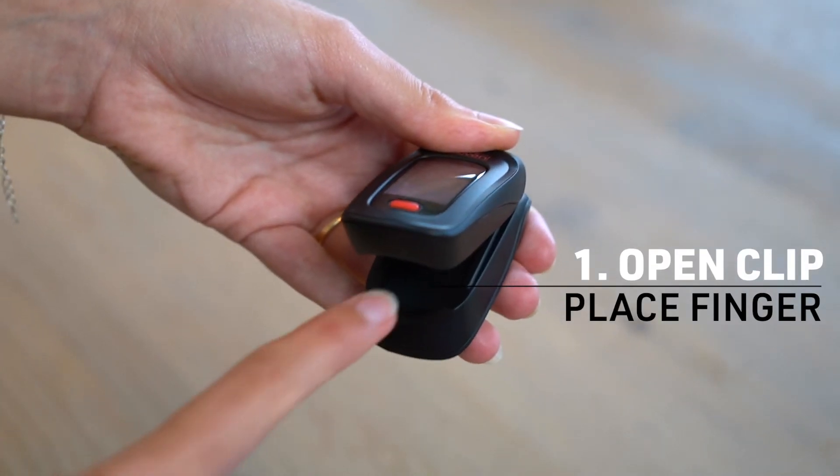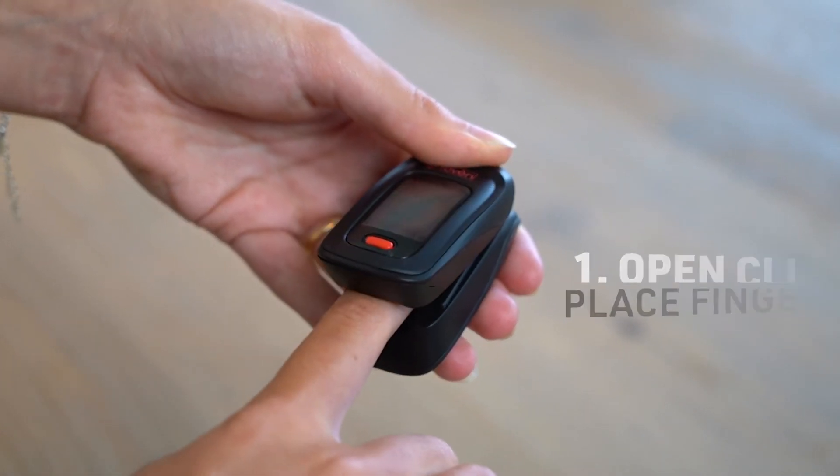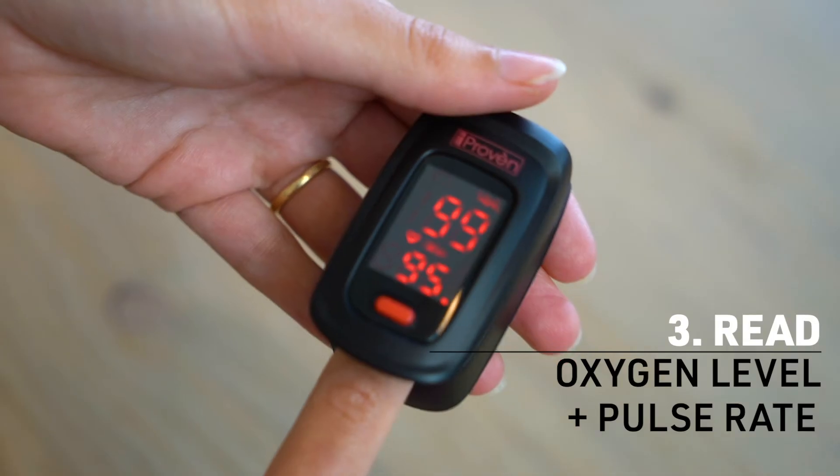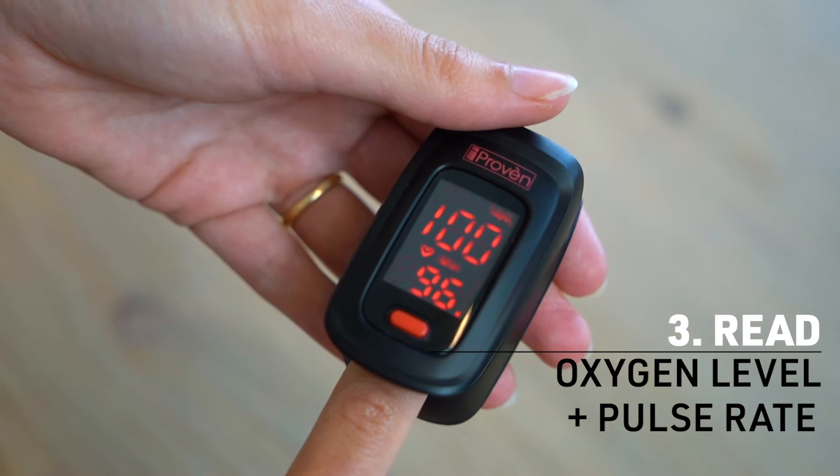How to measure in three easy steps. One, open the clip and place your finger inside. Two, press the start button. Three, read your oxygen saturation level and pulse rate.